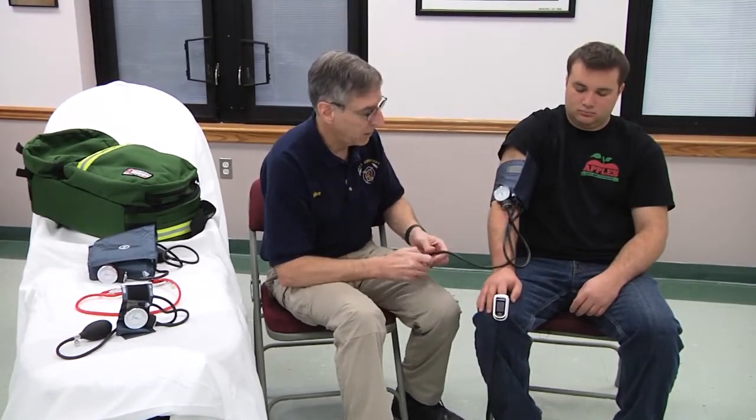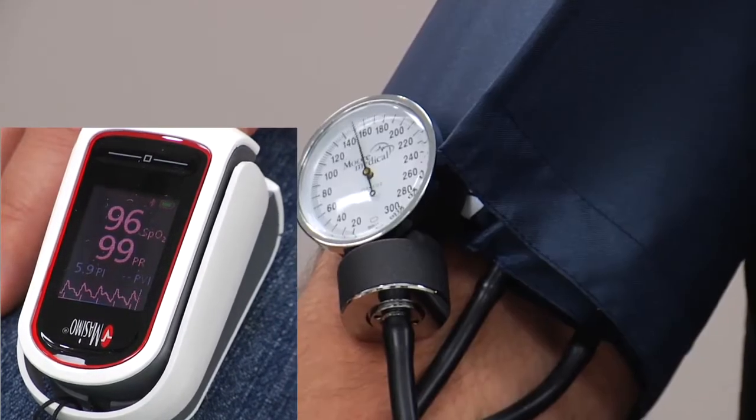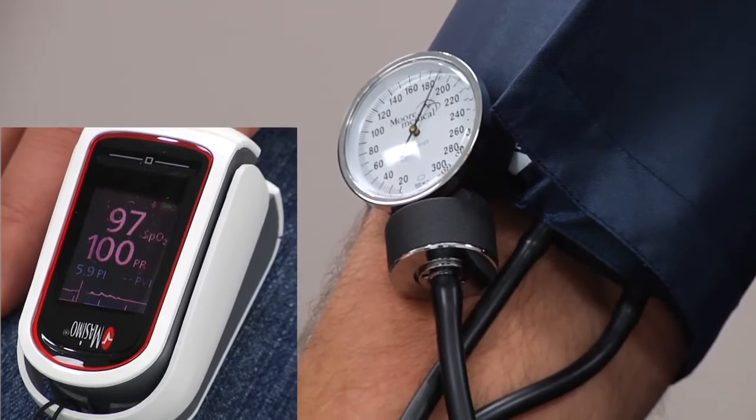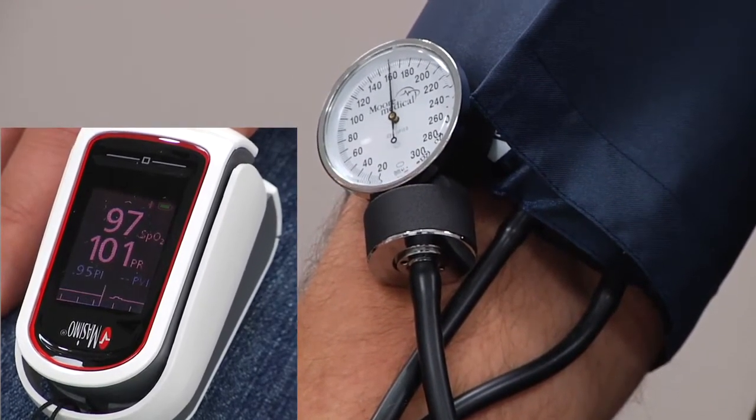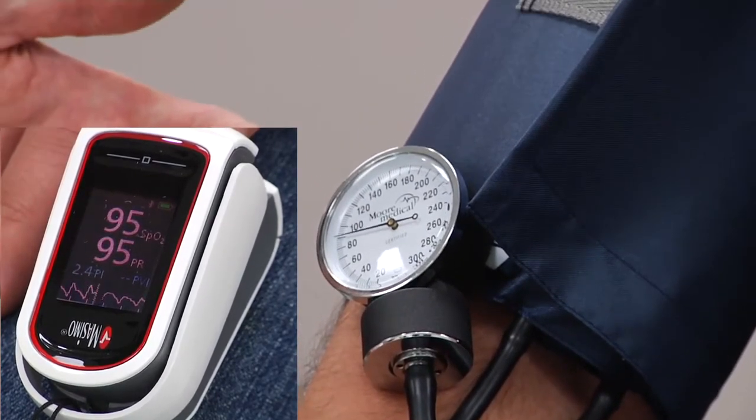We'll oftentimes write that as the blood pressure over P for palpation. If you have a pulse oximeter, you could put it on the patient's finger in the extremity that you're measuring. Pump the blood pressure cuff up until the pleth waveform disappears. As you let the air out, watch the pulse oximeter waveform reappear. I look at the blood pressure cuff at that moment and see this patient's blood pressure is 118 over P — palpation — or whatever abbreviation you use for pulse oximeter. This works well in a high noise environment or when measuring blood pressure in a moving ambulance.